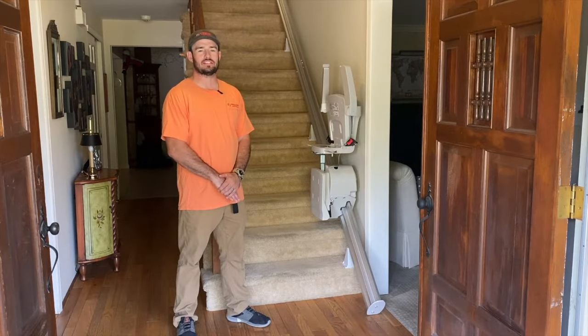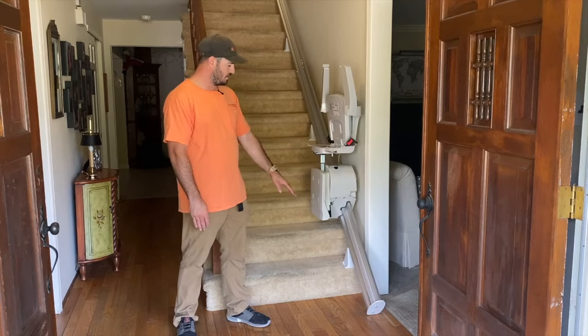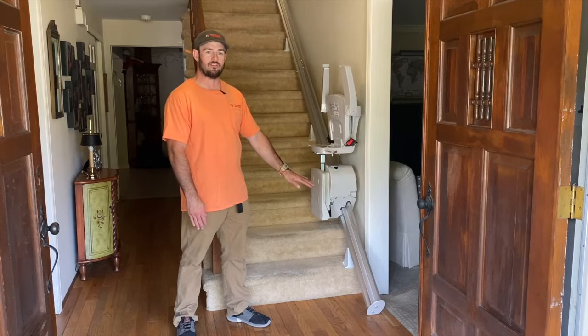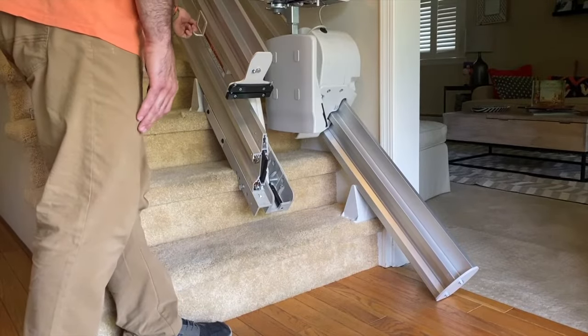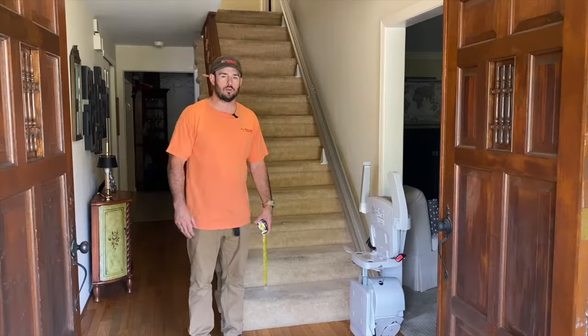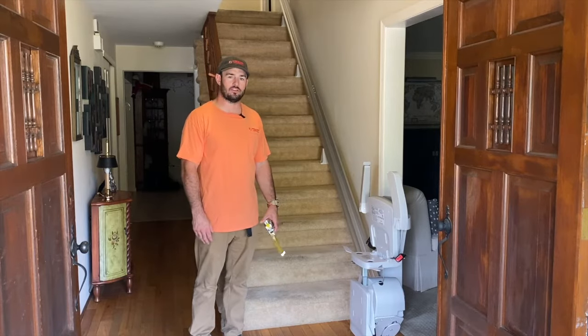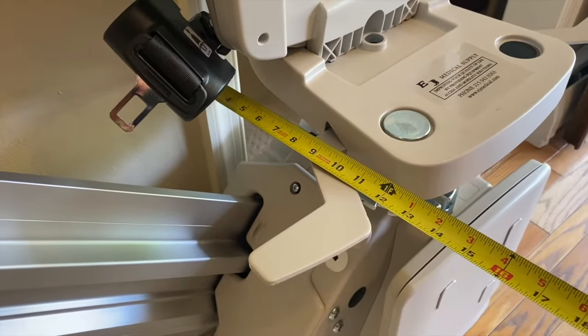Some of you watching this video may be asking why the track is sticking halfway into this door threshold. There is a remedy for this — what we can install is called a folding track, which lifts up out of the way so the track is no longer sticking out as a tripping hazard. The Bruno SRE-3050 straight rail stair lift folds up to within 13 inches off of the wall, and the track itself installs within 5 inches to the wall.